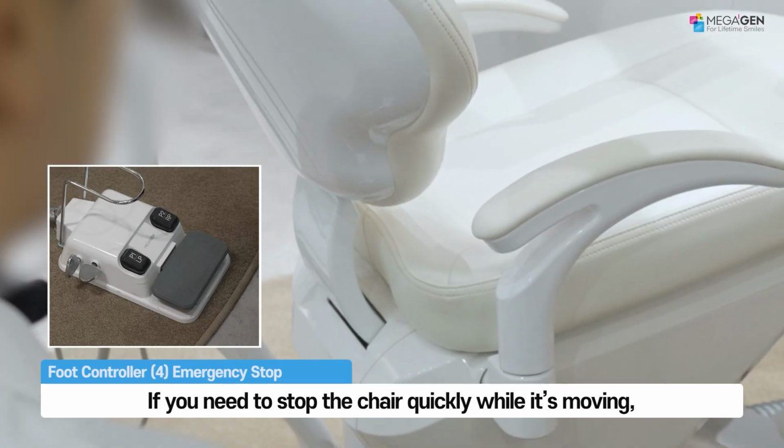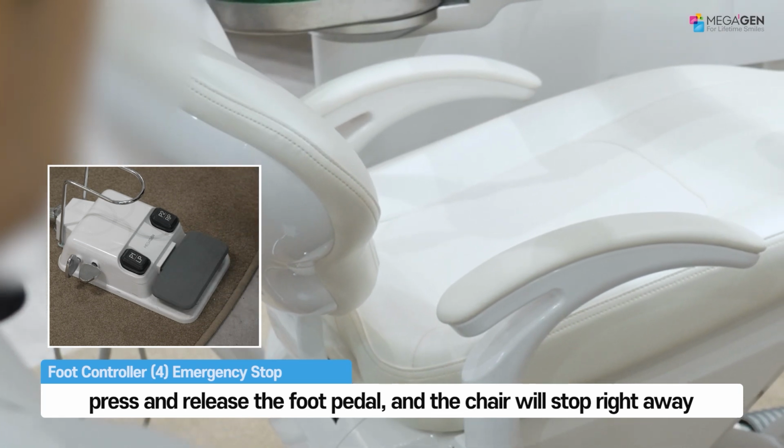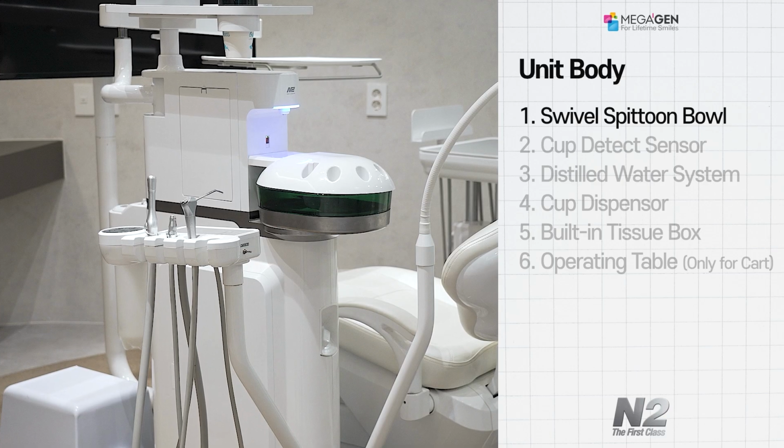Foot pedal emergency stop function. If you need to stop the chair quickly while it's moving, press and release the foot pedal, and the chair will stop right away.